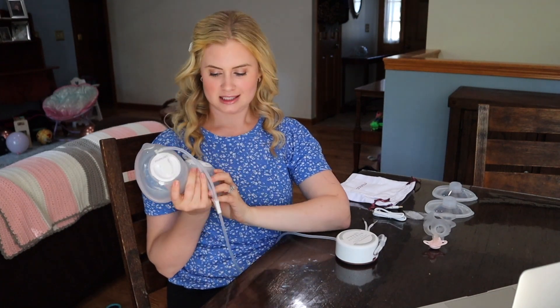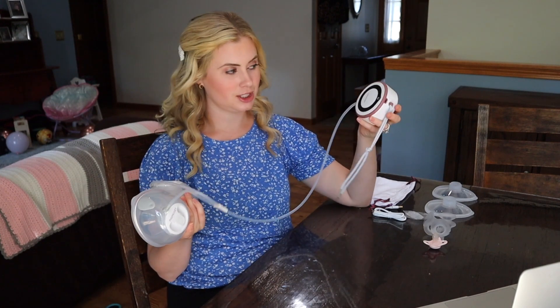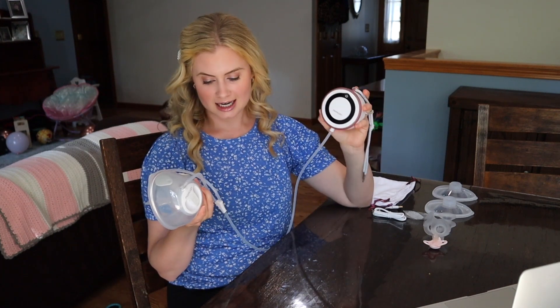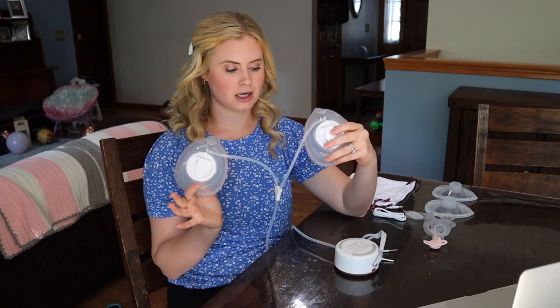Hey guys, today I'm talking about the Mom Cozy V1. This one is very exciting because it has a lot of similarities to the LB Stride, which is insanely popular, but it is much more affordable. I tried this one and I like it. I think it has a lot to offer and I think it might be a great solution for some moms.